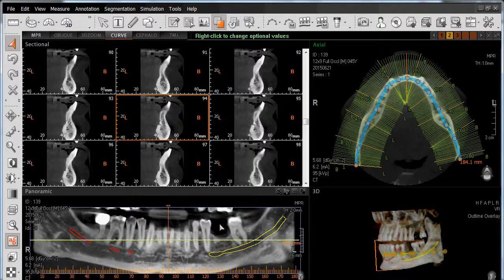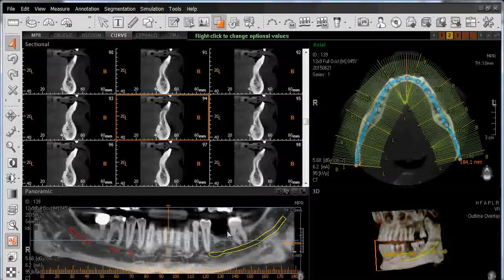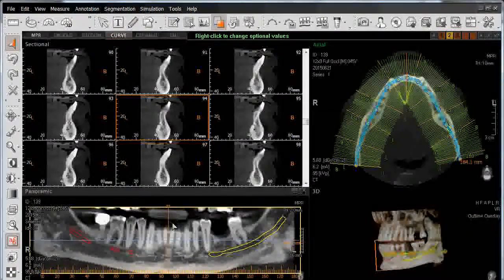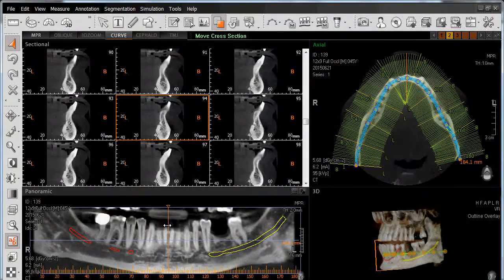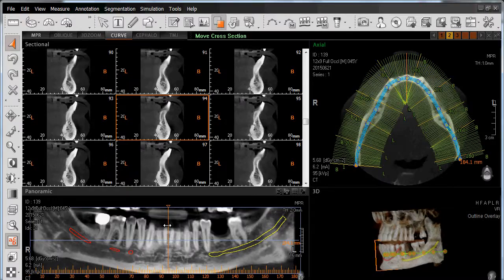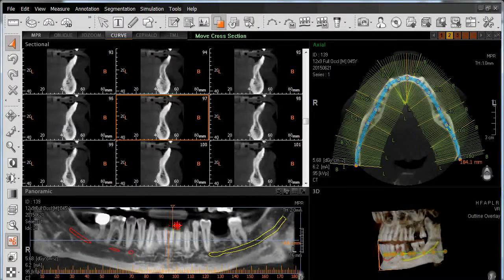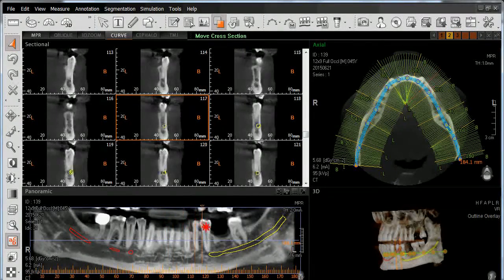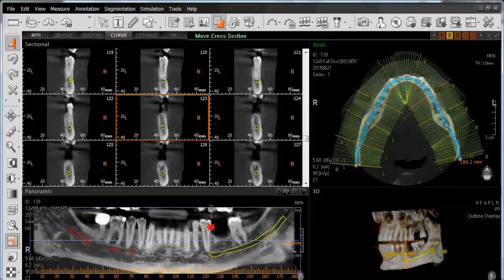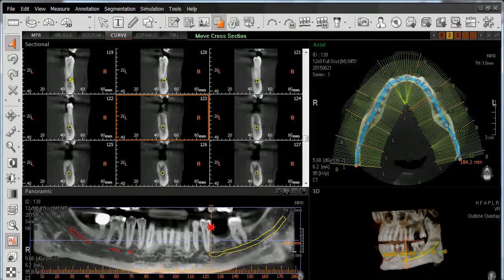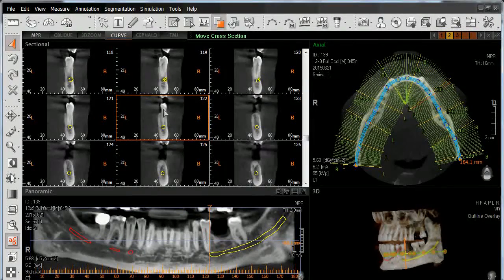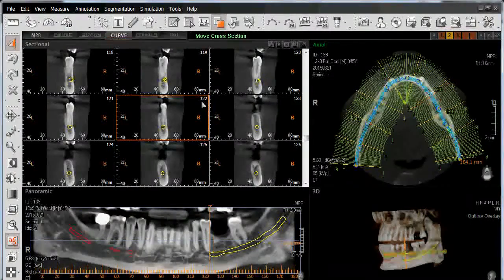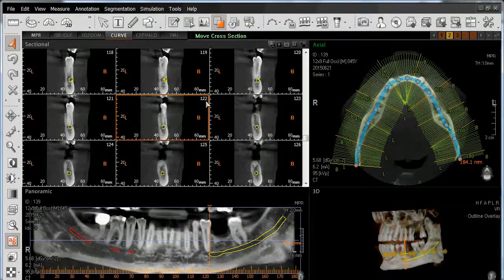To navigate to this area of our 2D pan reconstruction in our sectional window above, simply left-click on the vertical line and drag it across. We'll stop when we get to the distal edge of this second premolar, which we can see in sectional number 122.